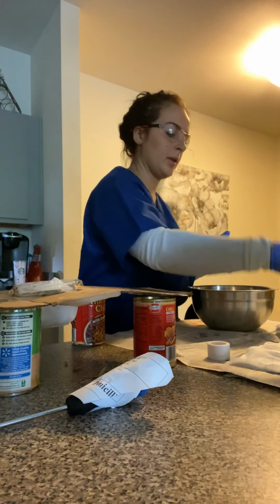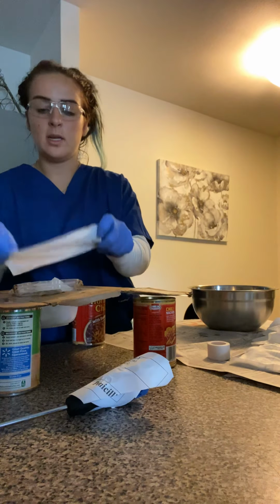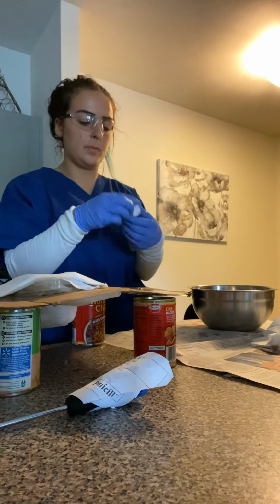There we go. At this point, I would take my dry dressing or a dry gauze and I would place it over the top. And then I would take my ABD dressing, which is right here, and I would place it over the top, taping it down with some tape.